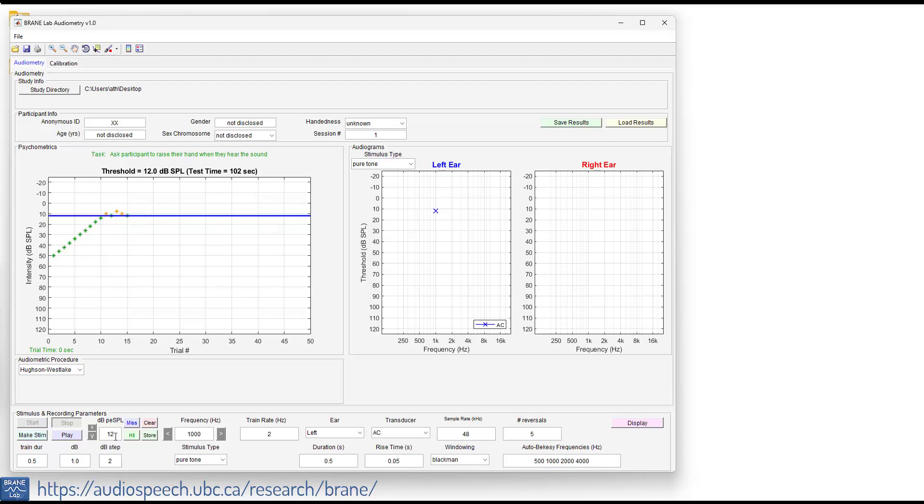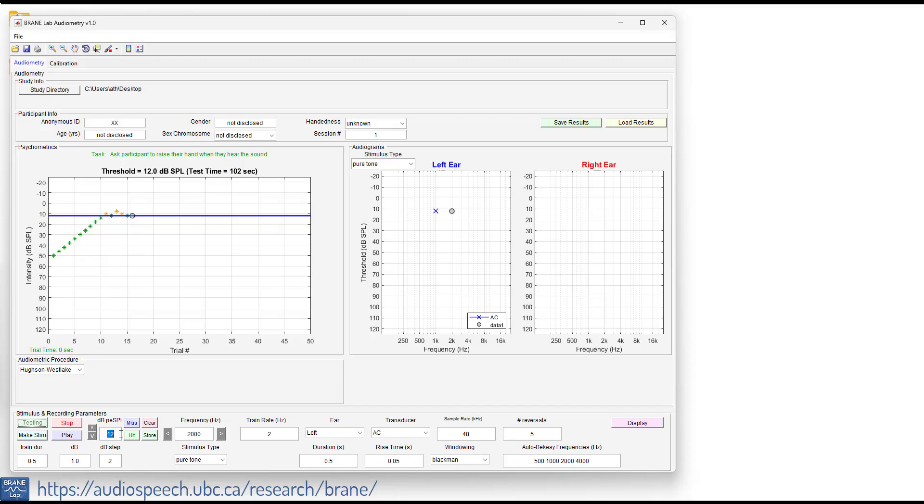So we can move from there to a different frequency. We go ahead and click on different frequency. You can see it shifted over to here. And we now need to make the stimuli, because currently that's still loaded up for 1000. So we go make stimuli to allow us to start here. Now I'm going to change this to 30 dB as a start intensity and then we go ahead and press play.